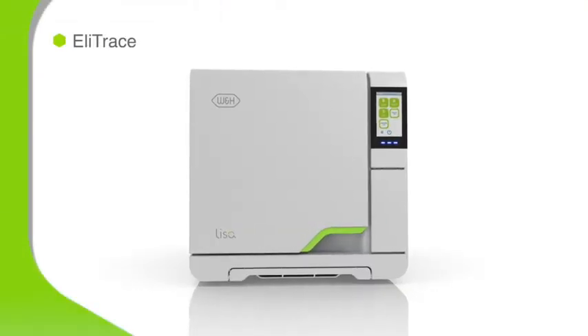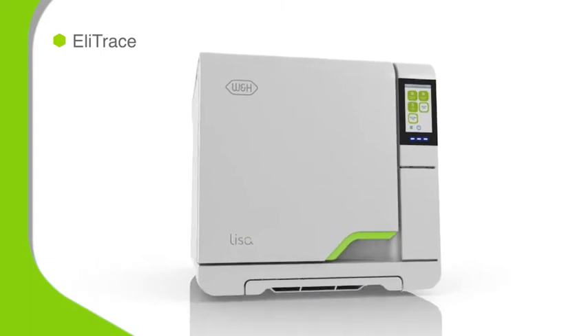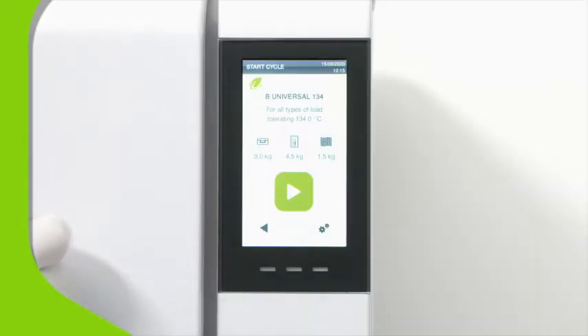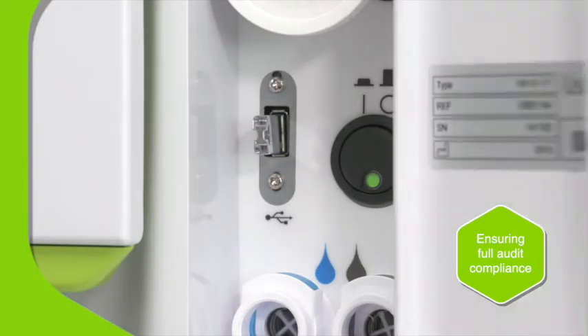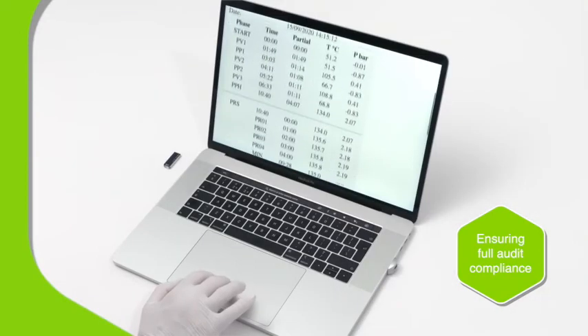EliTrace ensures that a digital trace record is made of each instrument that's vacuum sterilized on one of Lisa's B-type cycles. Cycle records are automatically stored on the integrated USB drive, available to view without any additional software.